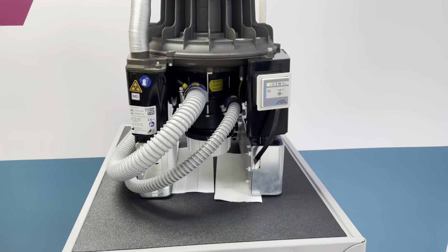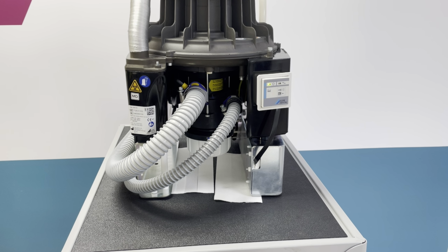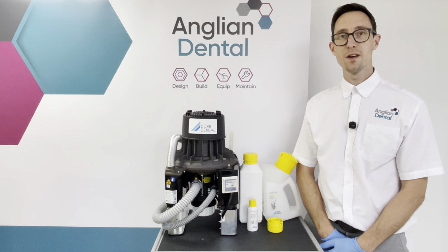What I do now is go back to the treatment centre, run some water down the suction lines or down the spittoon bowl, come back to the machine and just double check that there's no leaks or anything anywhere.